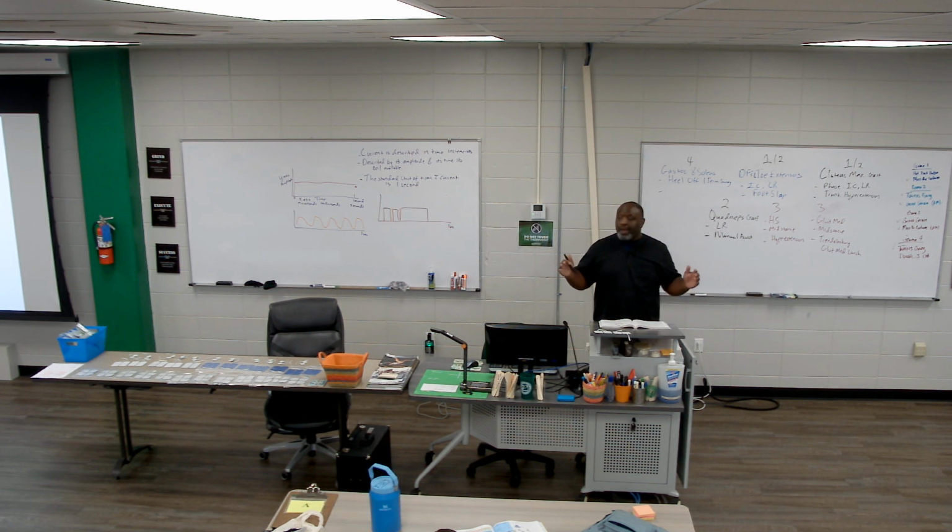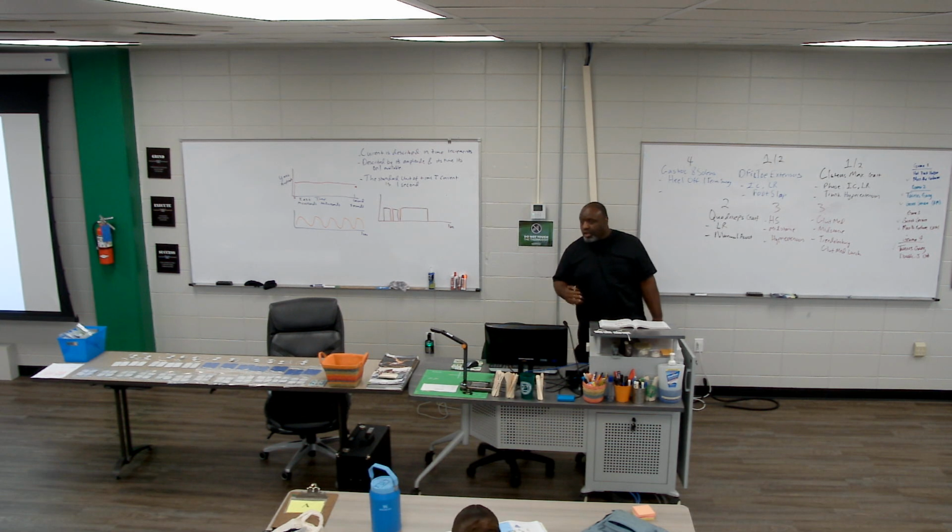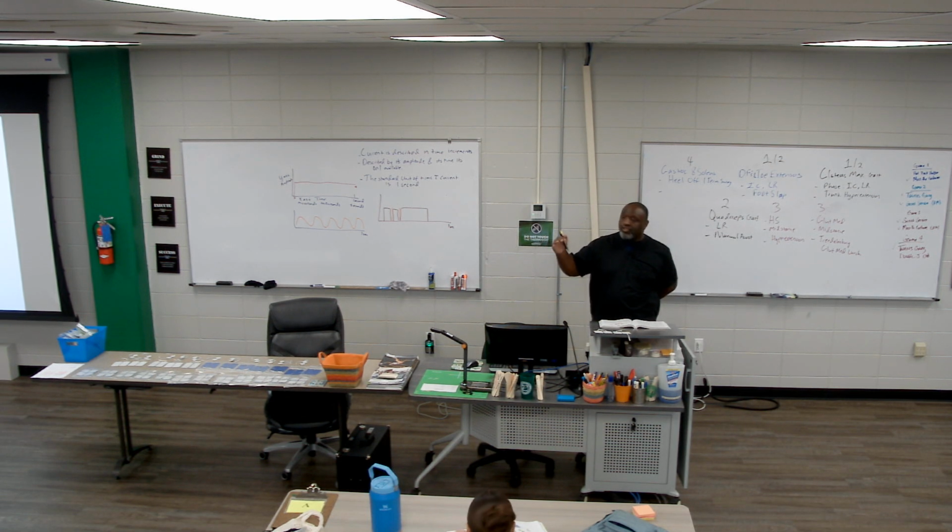The thing about these waveform types is we don't create these. All we do is select these. All of these are going to be predetermined by the manufacturer. So write that in your notes. We are not selecting these. We don't control this. These are predetermined by the manufacturer, the phases of the waveform. So the waveforms and the phases.